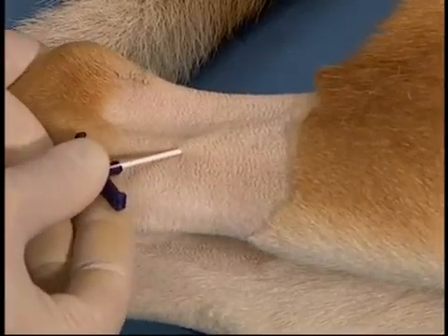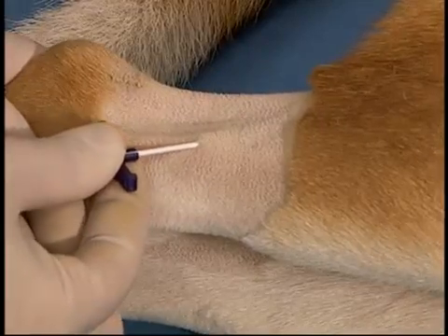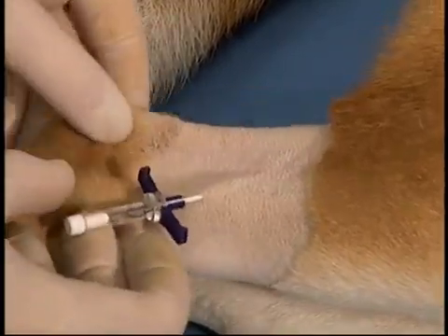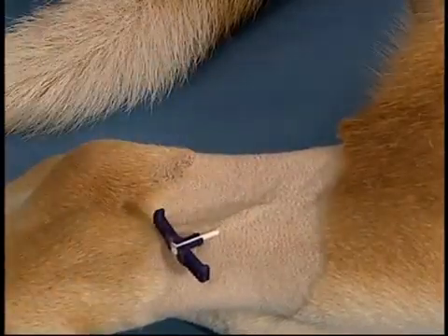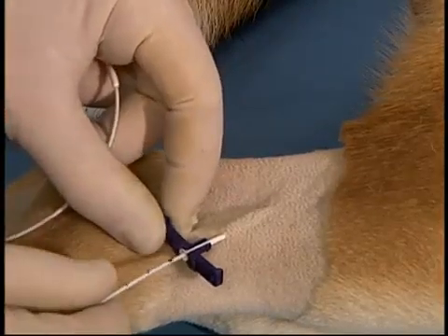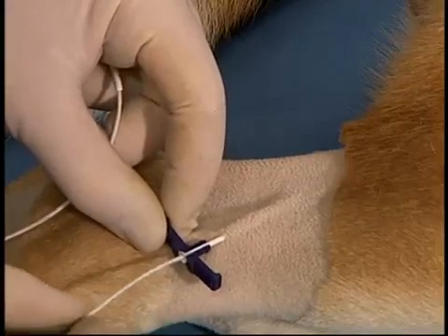This should be done in two stages since the saphenous vein has a tendency to roll. Once in the vessel, flashback should be seen into the hub of the stylet unless the patient is extremely hypovolemic. The stylet is removed and the catheter is inserted into the sheath. The catheter should pass extremely easily into the vessel. If there is any resistance, the sheath is probably not in the vessel but rather in the perivascular tissues.